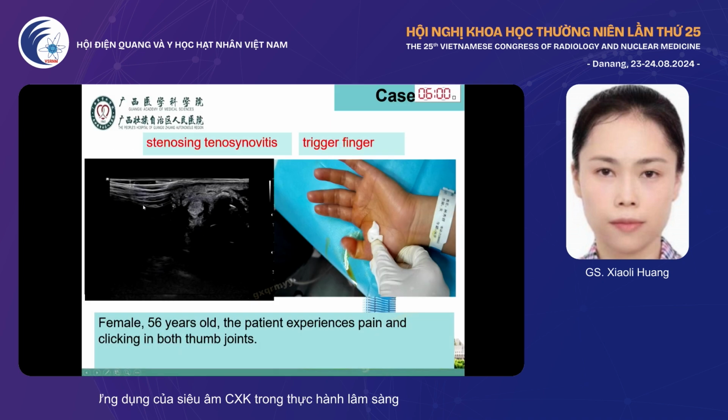The following video is us treating the patient's left thumb, first separating the tendons under ultrasound guidance, and then releasing the A1 pulley. After the treatment, the snapping of the patient's thumb disappears immediately.